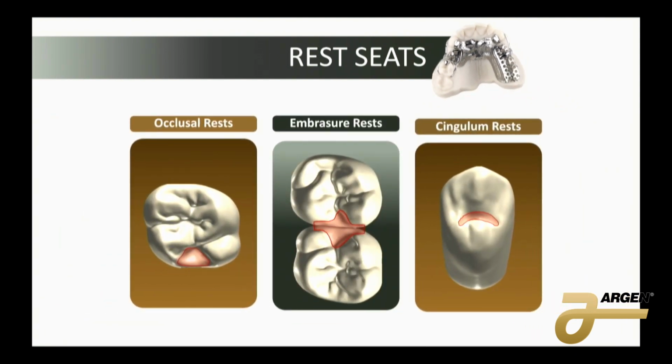So I'm only going over 3 really basic rest seats, and this is something that you can talk to your dentist about. If they don't really know how to make a good rest, it's really good that you understand what a good rest looks like, so you can have that conversation with your clinic. Because if they are constantly having partials that aren't working, that aren't fitting right, that are failing a lot, maybe you need to have a discussion about how they're prepping the cases.